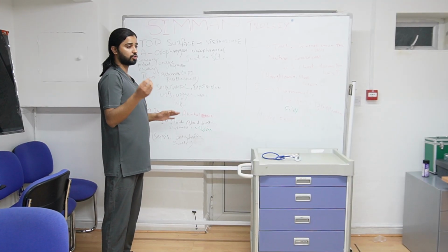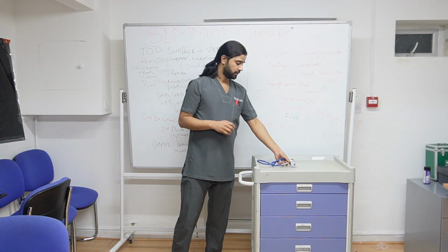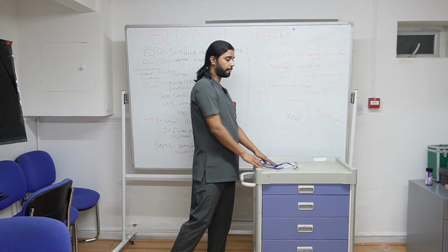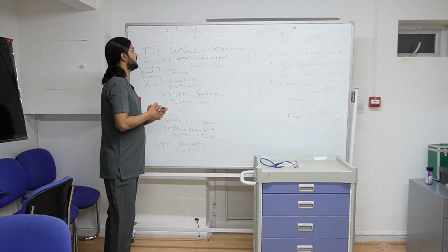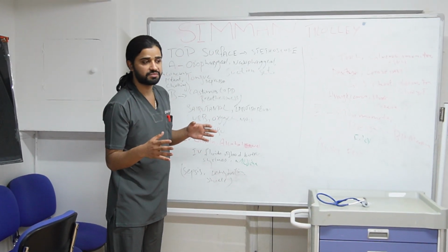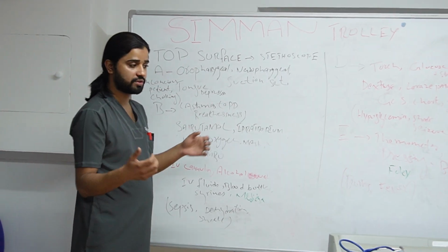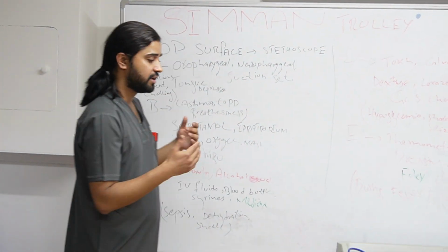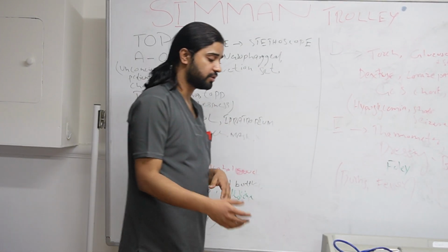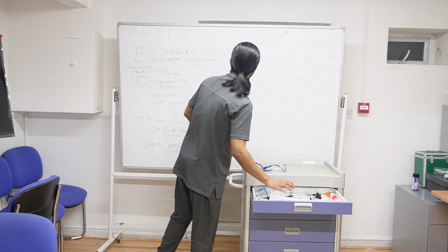Alright. Okay, so now I am going to discuss from where you are going to find the relevant things. Doctors, most of the time the stethoscope will be on the top of the trolley. It might not be there, but most of the time you will find it on the uppermost top of the trolley. Next, doctors, just follow the ABCD guideline, meaning which thing you need in which system, just open that door. Suppose you are assessing the patient's airway and you need an oropharyngeal airway, nasopharyngeal airway, suction set, tongue depressor, always open the topmost trolley. Alright, you are going to get those things there.